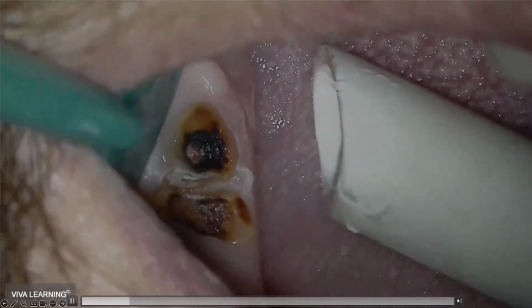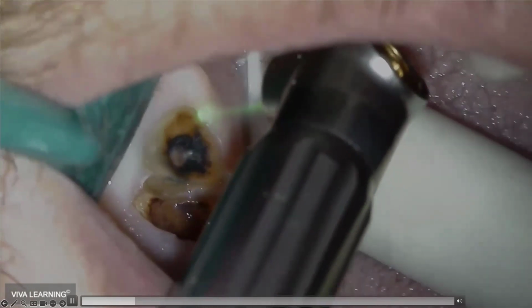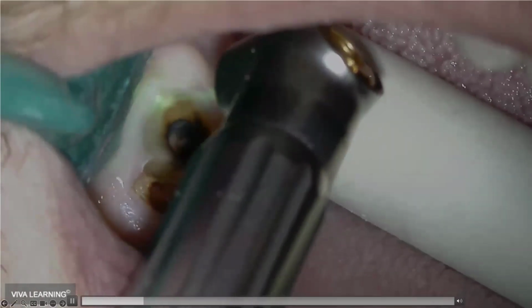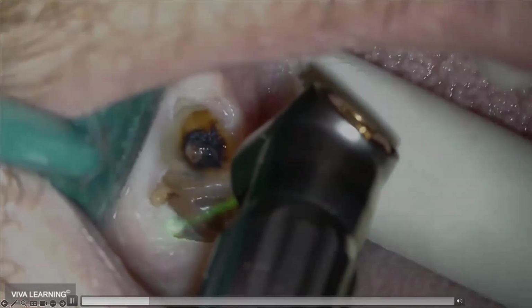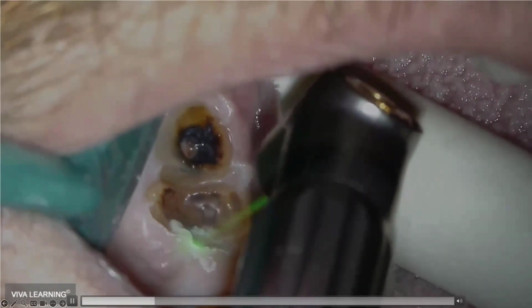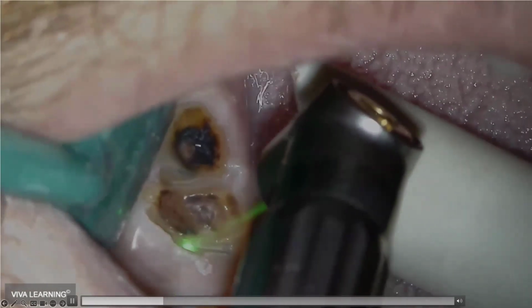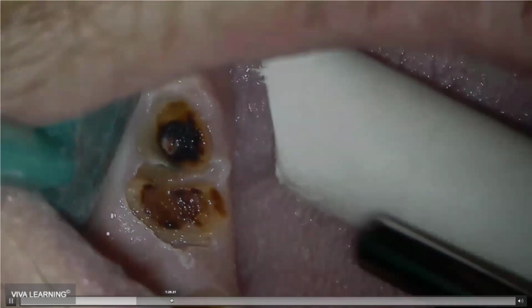So what are the contraindications for the patient? We have all these other things, right? Like blood thinners or a pacemaker, or, it's basically there isn't any. Even for a patient who's pregnant, we have a laser that is operating in the infrared range, right? So I don't have to necessarily worry about radiation, where we wouldn't want to do an X-ray. No question, I can just basically go in there.